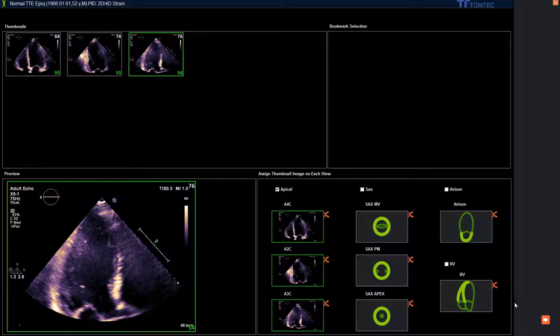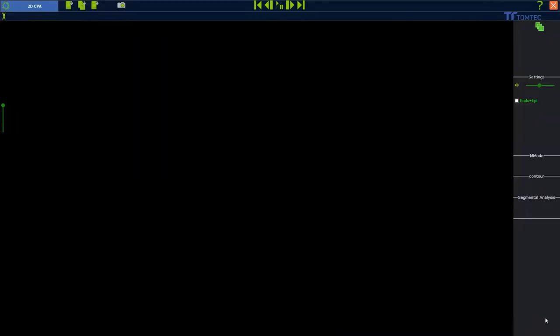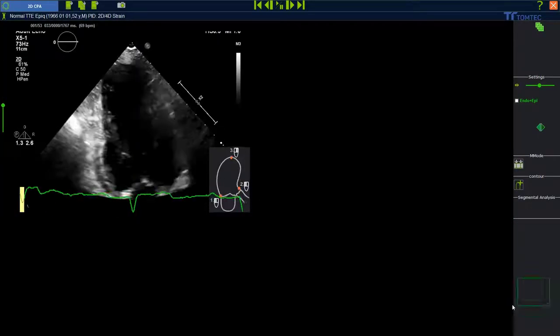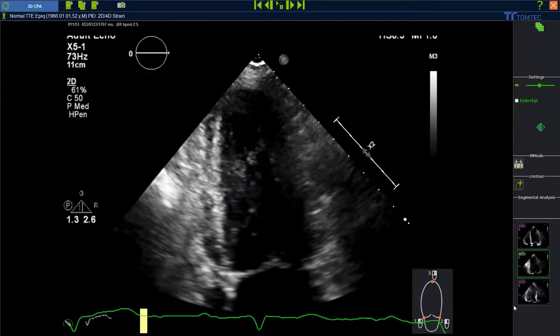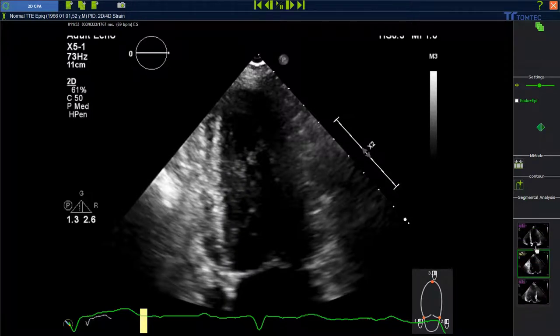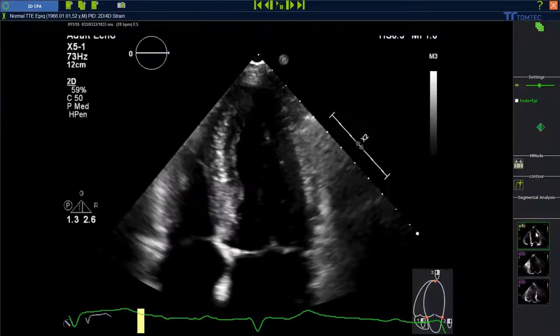To start the analysis, click on the arrow. You can see all three planes on the right. Starting now with the 4 chamber view — you can also use the other planes.